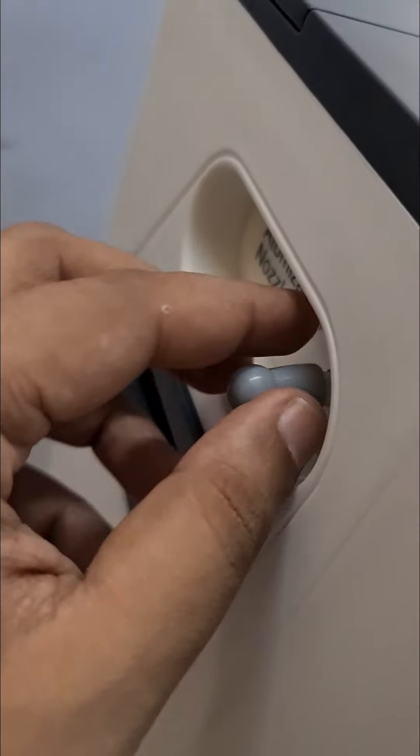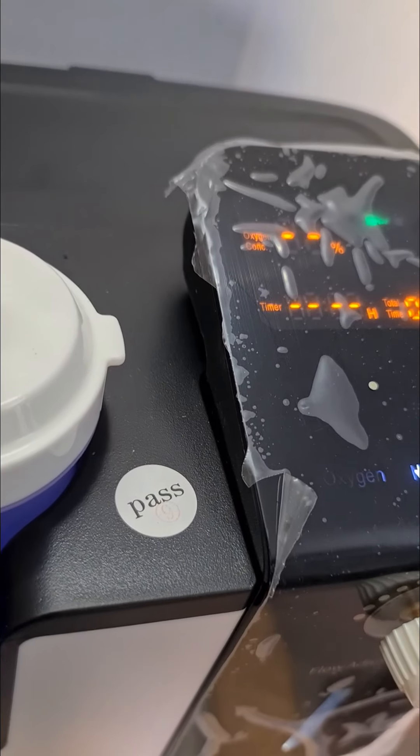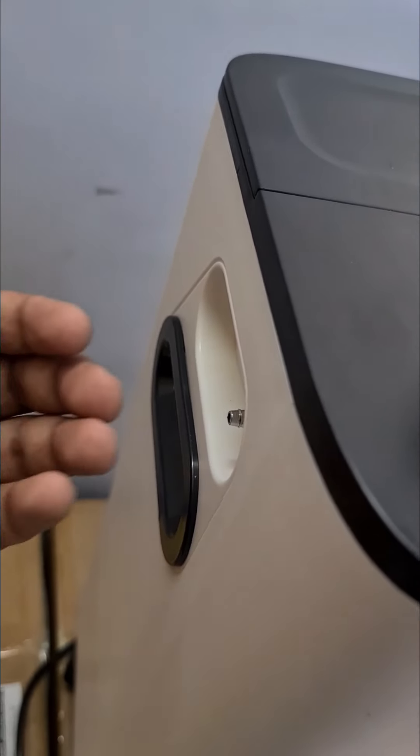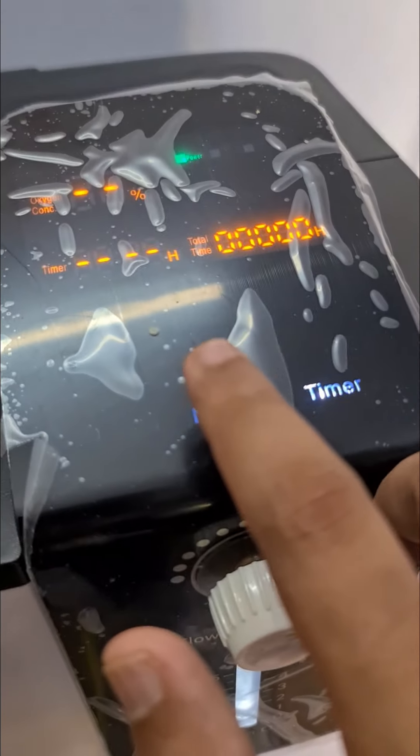Now coming on to the nebulizer option. The nebulizer port is given here — remove this carefully. If you want to start the nebulizer, just press this button. You will see nebulization starting to come here. Now you can add the nebulizer port and start to use the nebulization. Same way, when you want to switch it off, just click the button once again.